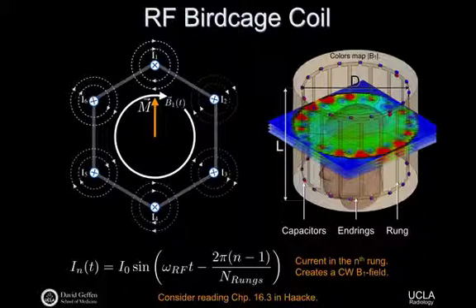Just like this example here, and I'm sorry it's not labeled, you're right. This is also looking at an axial slice. What this is showing here is some simulation work, not from our group, from another group. It was labeled on a previous slide, about the uniformity of the B1 field that you get with this kind of design. So it's non-uniform in places you don't care about, way out by the edges of the coil, but it's quite uniform, say, across the head itself, for example.